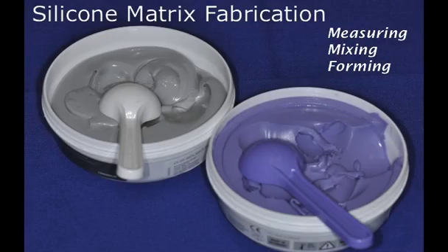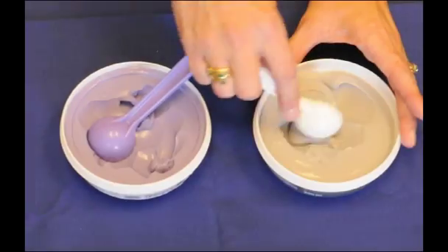In this video, I'm going to demonstrate how to make a silicone matrix, whether for a reduction guide or a provisional matrix.